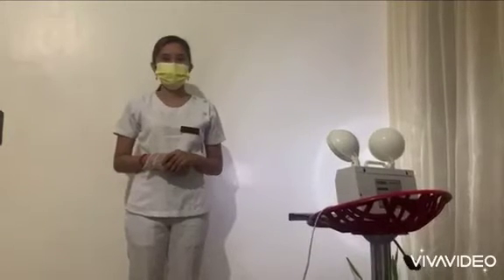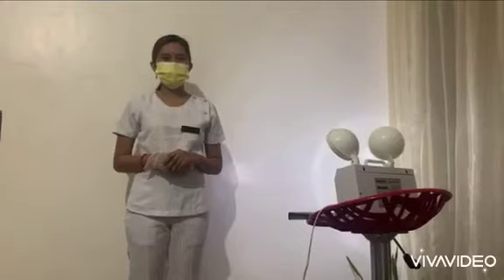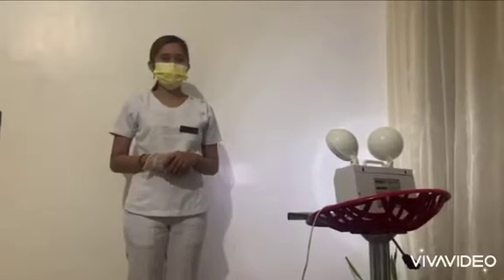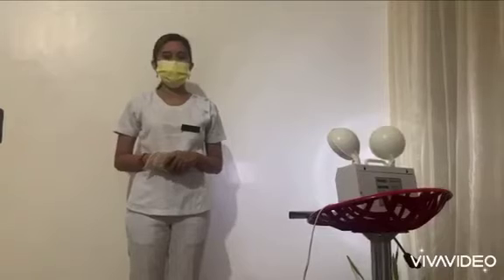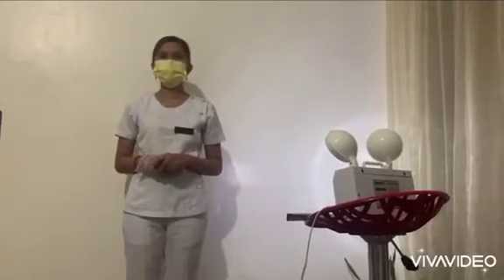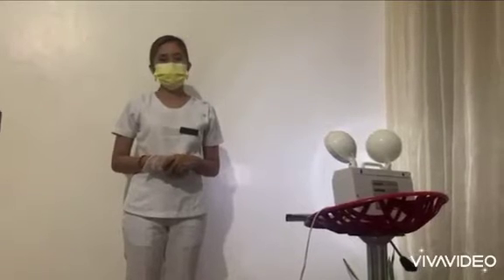If we were using this as part of the scapula series, then the scapula would be lateral, and we call it a lateral scapula. We're doing this as part of a routine shoulder series. It's an oblique because the shoulder is actually oblique, and the shoulder is the area we're interested in.